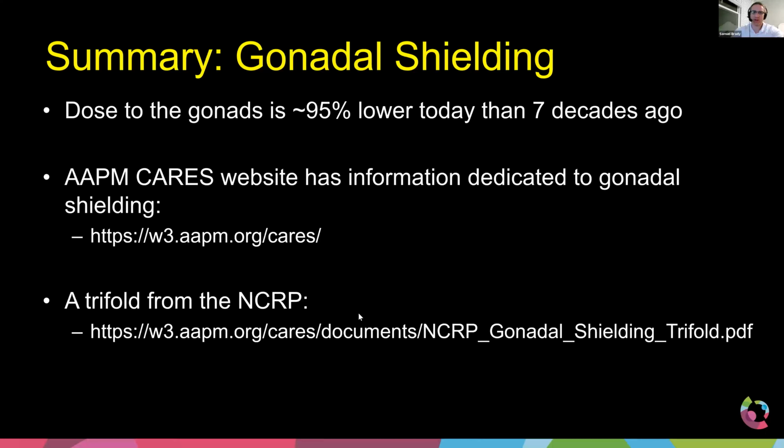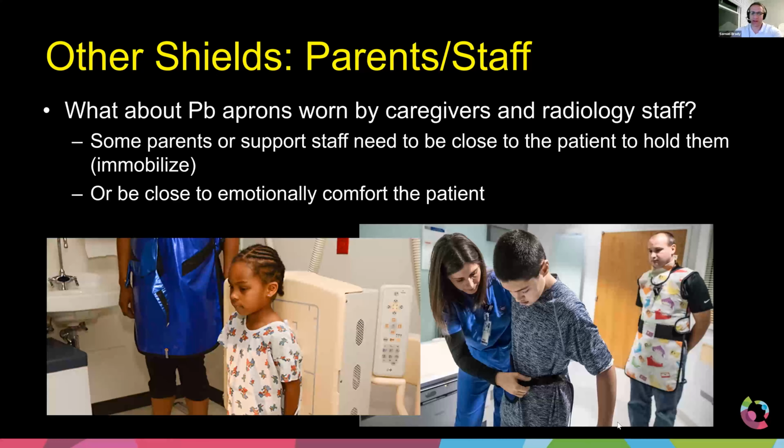There are a couple of things going on here. There's the lead apron that we place on our patient, the gonadal shielding or out-of-field-of-view shielding. Usually we place it on the lap apron or the pelvic apron. Those aprons really don't do much. As long as the radiation beam, the light field, is not striking where the shield is, the shield is not stopping radiation.